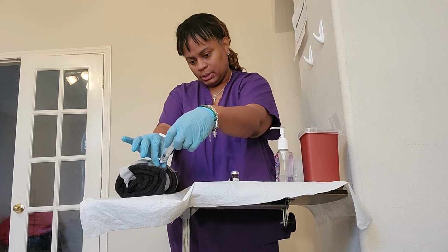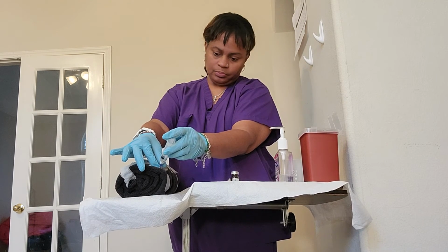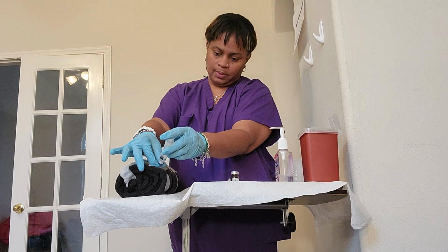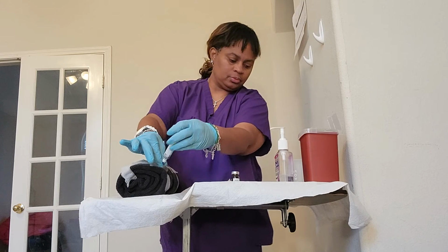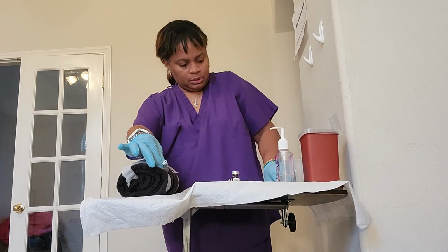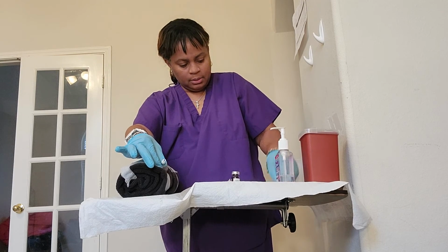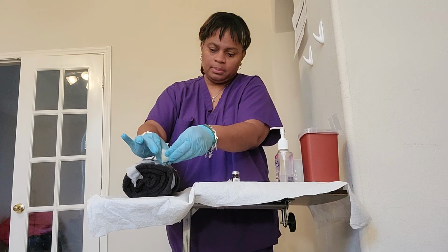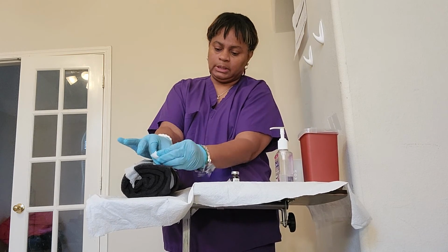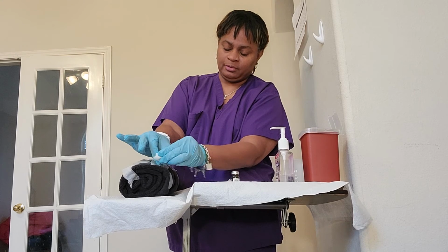We'll do that kind of slow there. All right. And we're going to get the alcohol pad again. Careful not to touch the hub. And we're going to clean it one last time, or one more time.